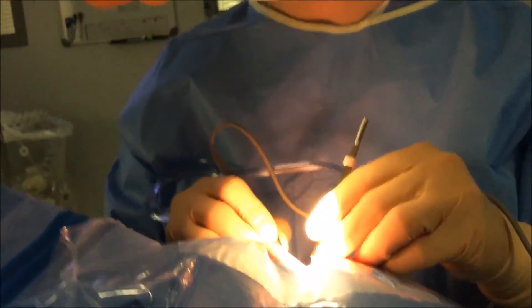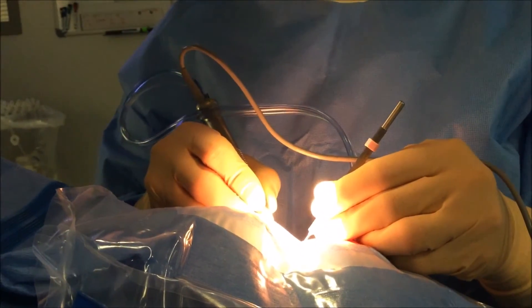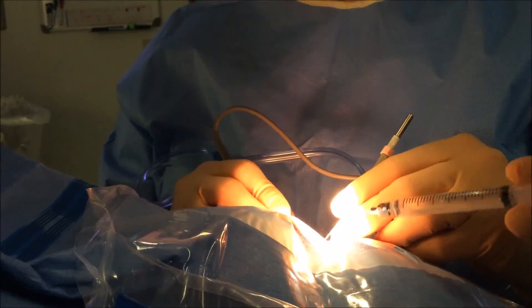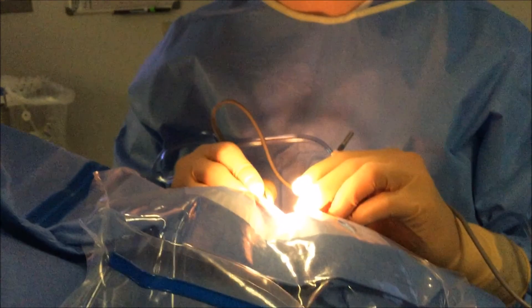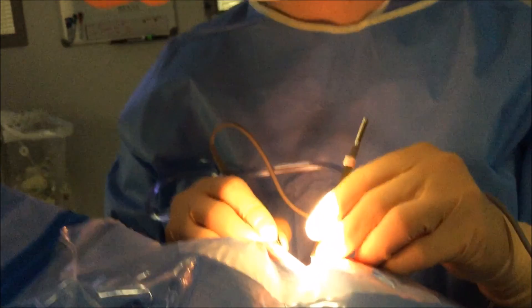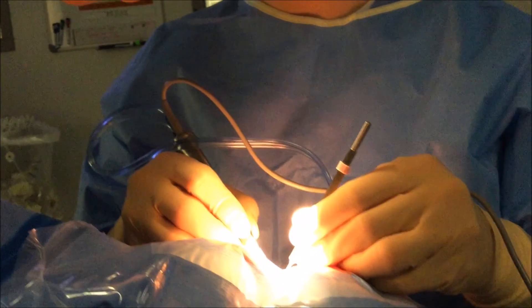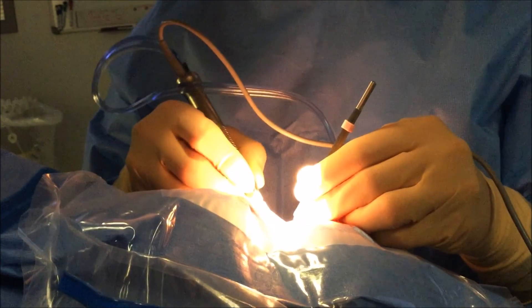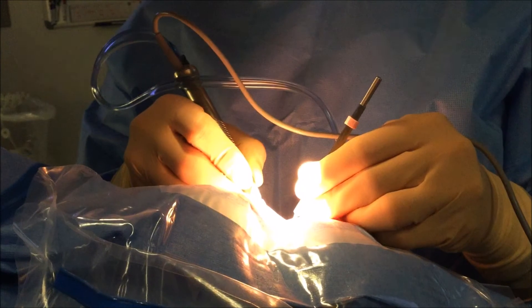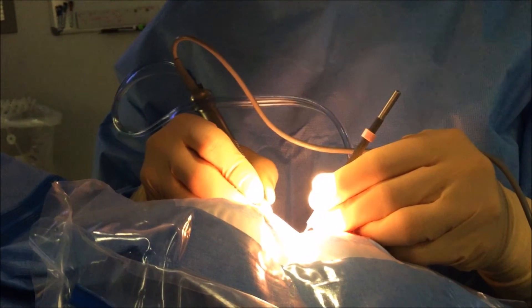Here's another example on the right eye — you can see the chopper is being placed out and then the facotip is placed in a vertical position. The double chop is performed, and then the chopper is rotated, slid under the anterior capsule opening, rotated into position, and then the cross chop is performed. All that happened very fast, so let's do that one more time. The chopper is being slid out to the equator in super slow motion. Now the chopper is rotated into normal position, then I'm supinating my hand and the chopper is in proper position — the ready position for the chop. Now the facotip is placed in a more vertical position in order to stab the lens more effectively for the double chop. And then you crack.